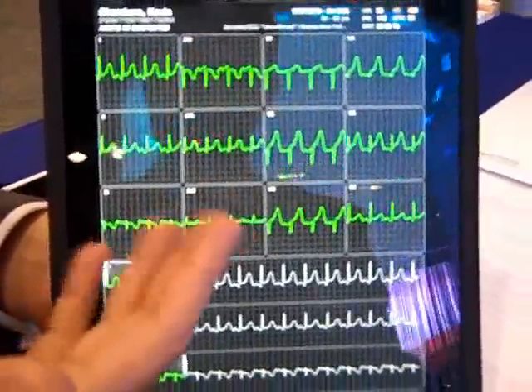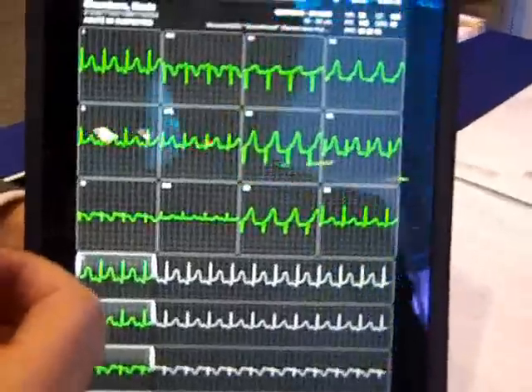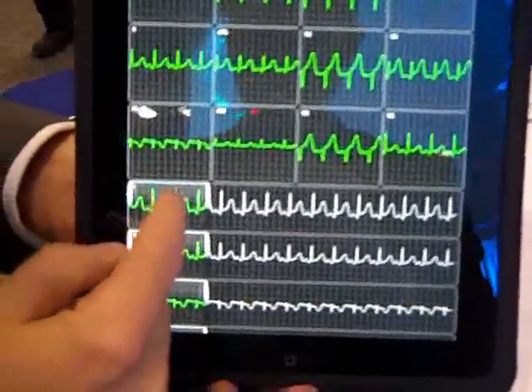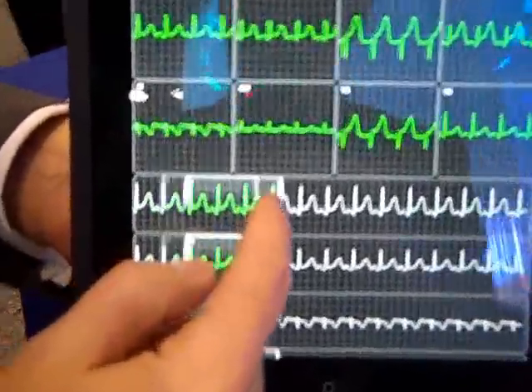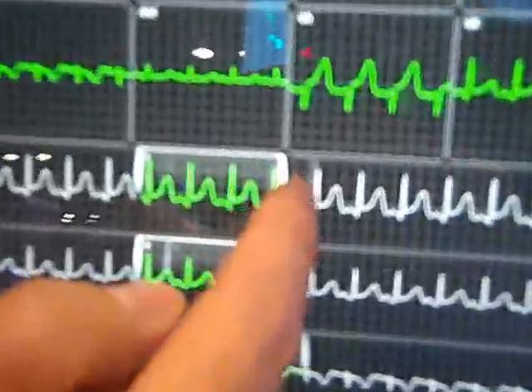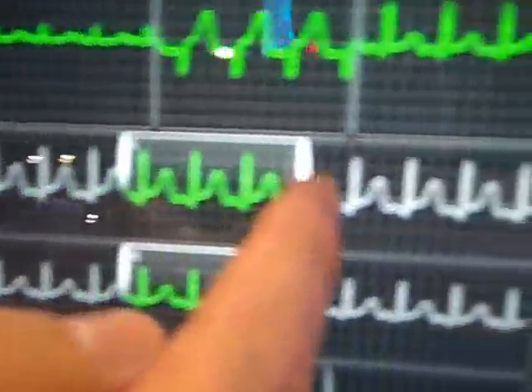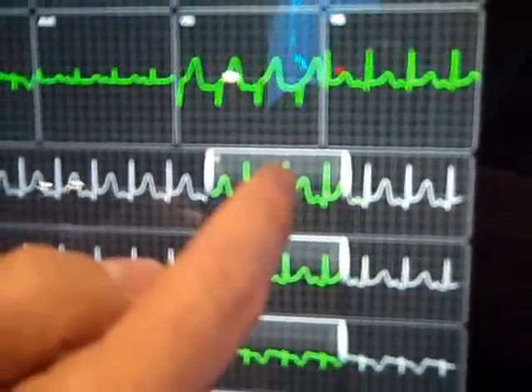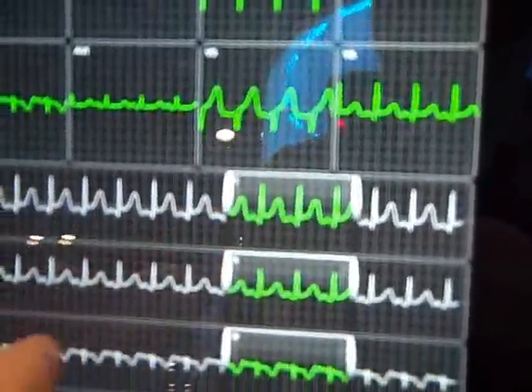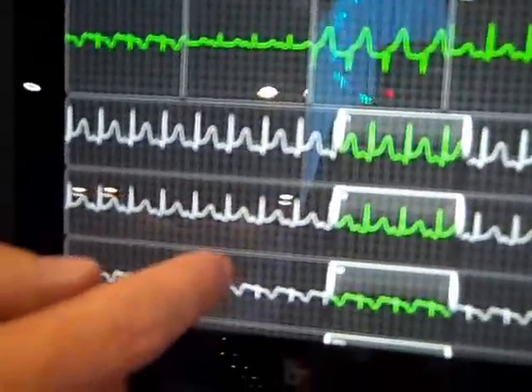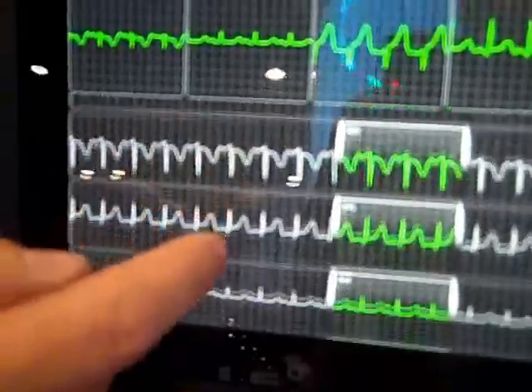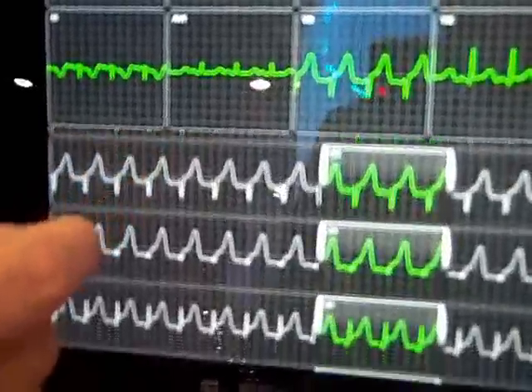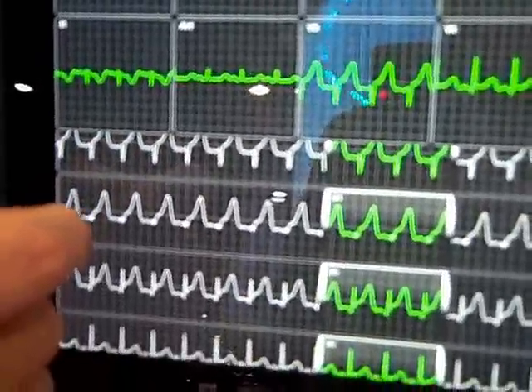This actually takes the raw XML feed from the GEMU system, which now gives me a full 10 seconds of all the data. The physician is now in control of which beat they may want to do further analytics on, as well as any one of the leads can be the rhythm strip.